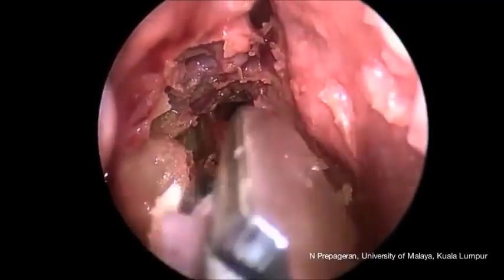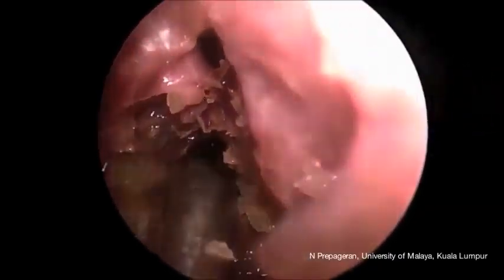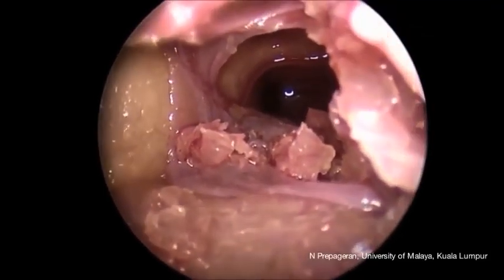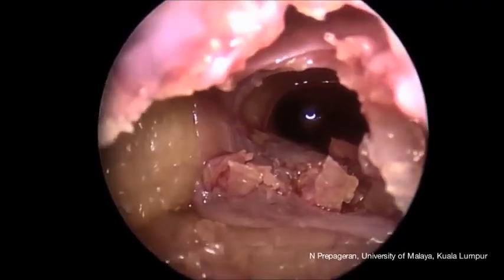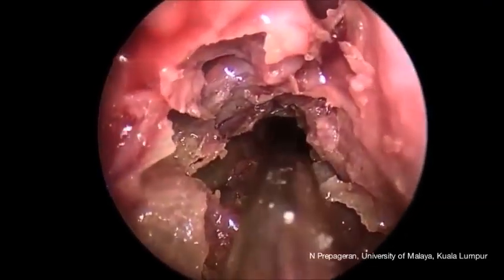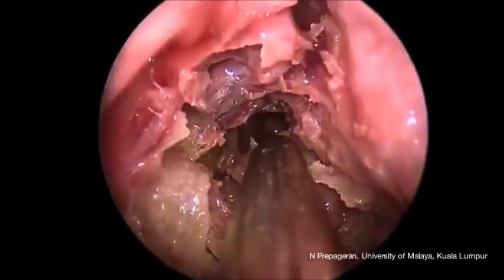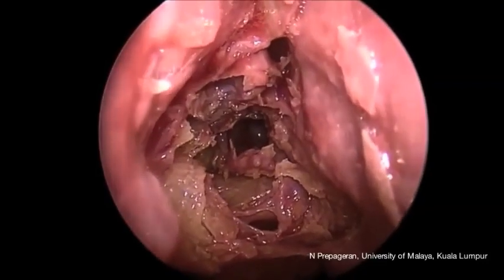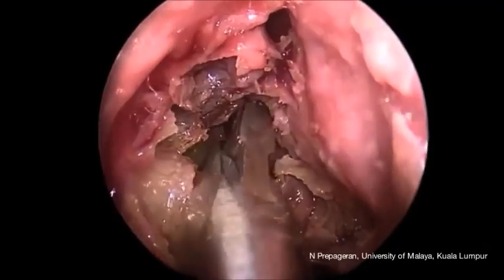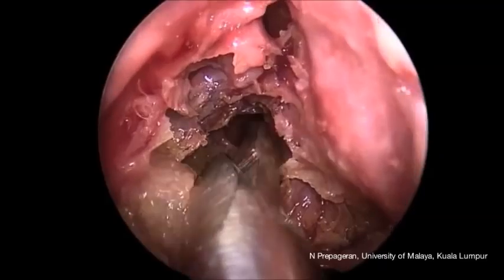That is the mucosa of the posterior ethmoids that we are stripping, which in real life we will not do, but we do it more for the cadaveric dissection. And that's the view of the posterior ethmoids itself. Subsequently, let us clear up a little bit more so that we can appreciate the anatomy a bit better. So now, we're using the forceps to remove the mucosa of the posterior ethmoids.